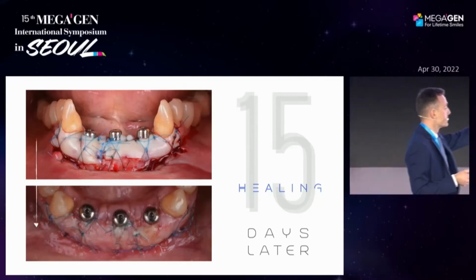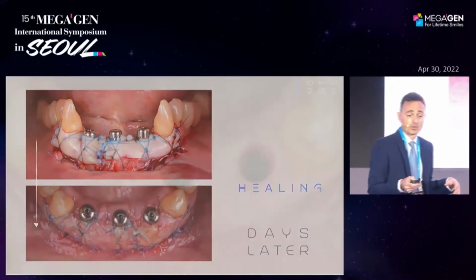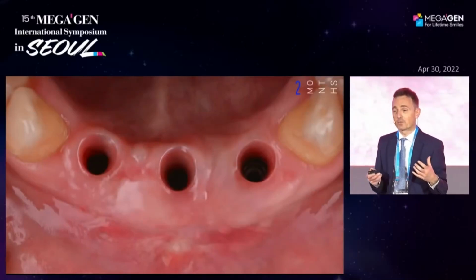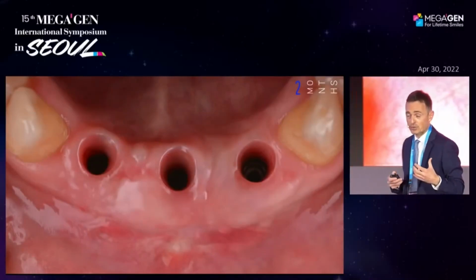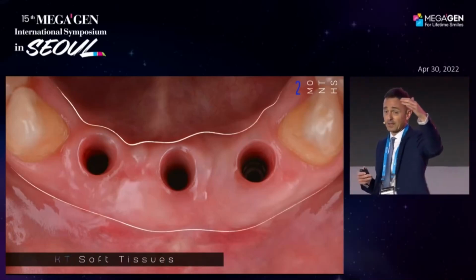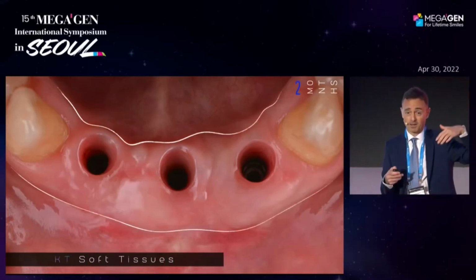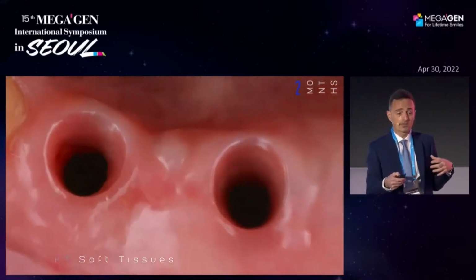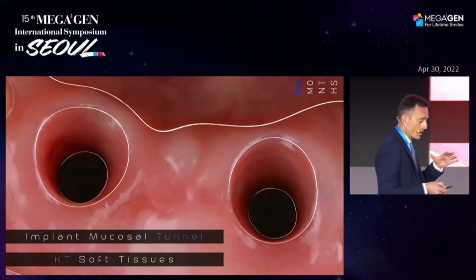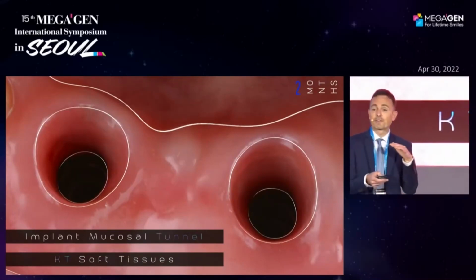And I'm more than happy to see this final result after 2 months of maturation of the soft tissue. I'm happy not just because I have keratinized soft tissue around the implant in the lingual and buccal parts, but also because I finally have a thick gingival phenotype.